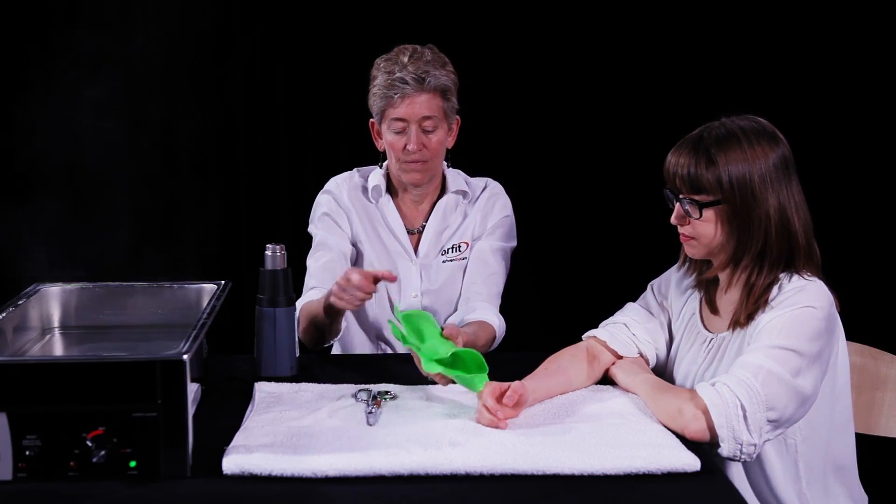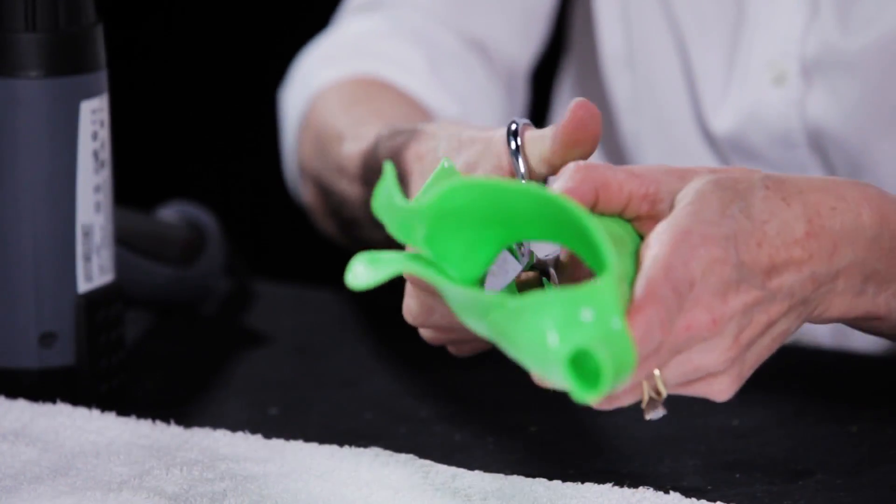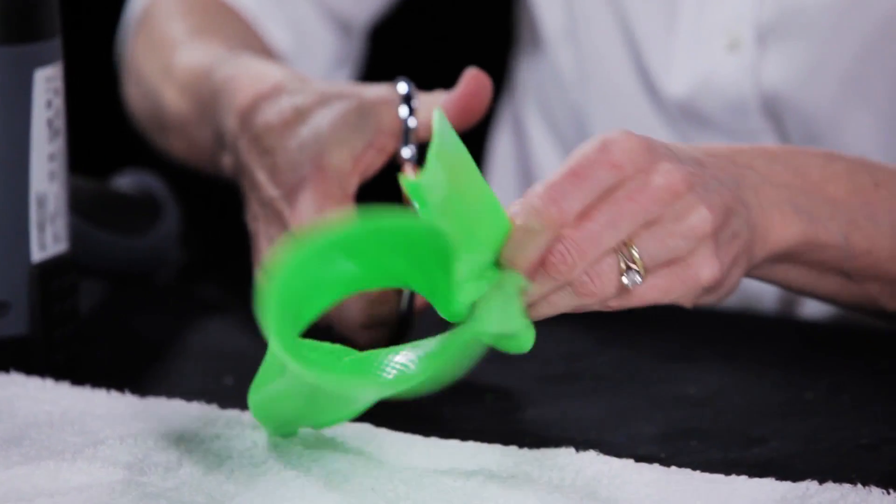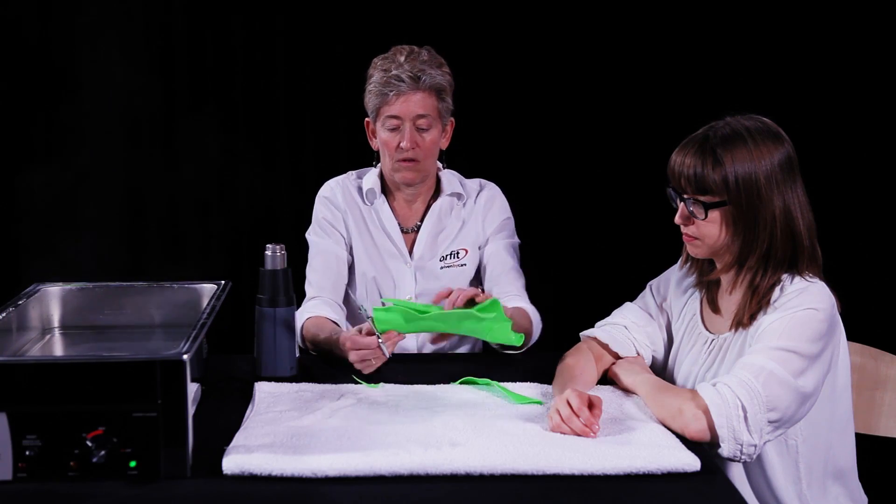Trim away the pinched areas, rounding all corners and leaving a nice smooth edge. Make sure the thermoplastic material does not overlap over the patient's forearm as this will cause pinching of the skin.